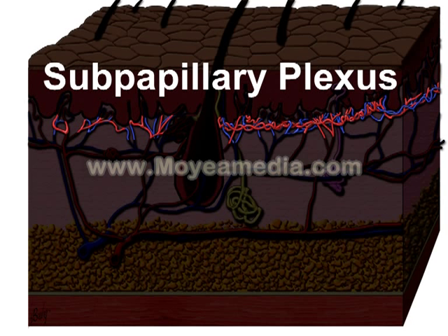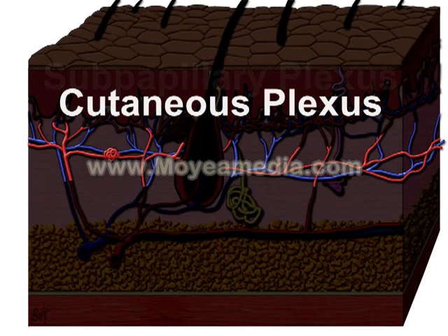The subpapillary plexus is the location of the postcapillary venule, which would be the site for most leukocytoclastic vasculitis. The intervening cutaneous plexus is composed of perforating vessels and is really sort of a no man's land in terms of discussion of superficial and deep infiltrates.